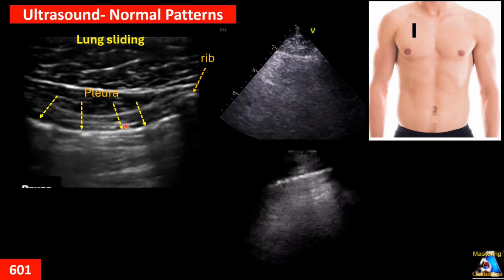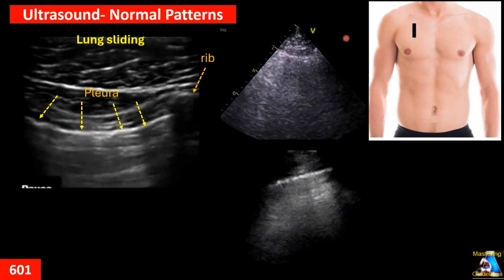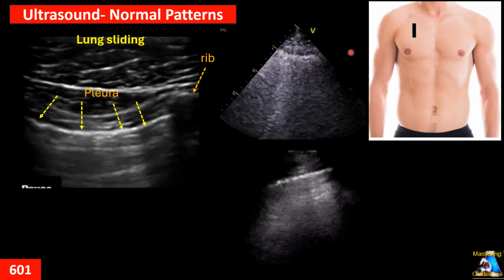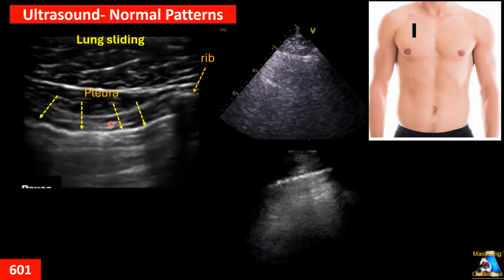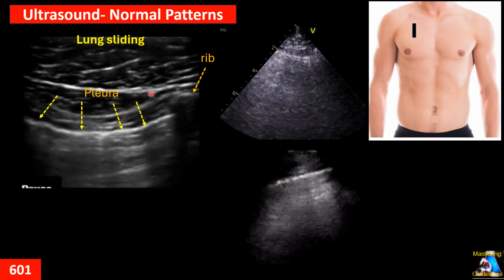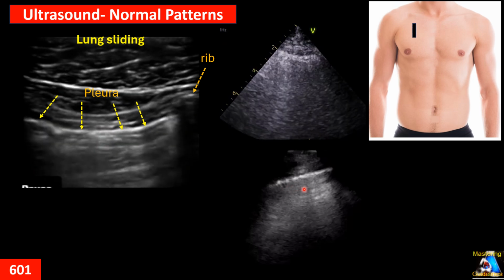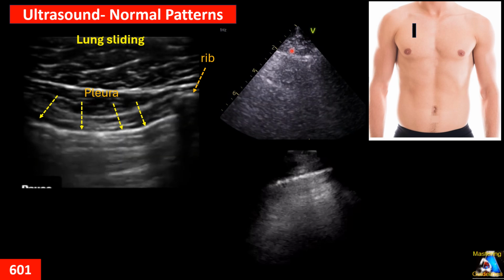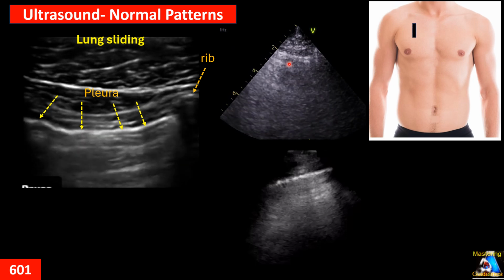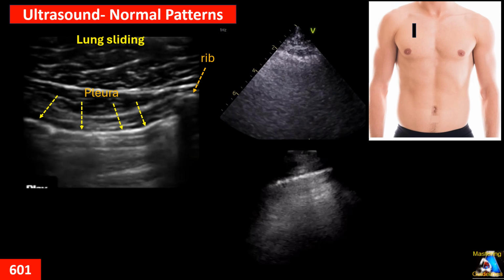That is a very important feature in a normal lung on ultrasound. This feature can be seen much better with a linear probe because the high frequency and resolution are much higher. We can decrease depth, but with the curvilinear and sector or echo probes, we can see it, we just have to optimize it, but the sliding is not very clear on the other two.